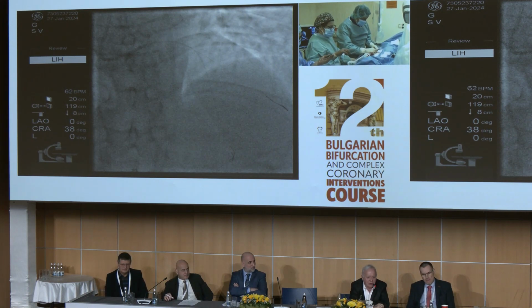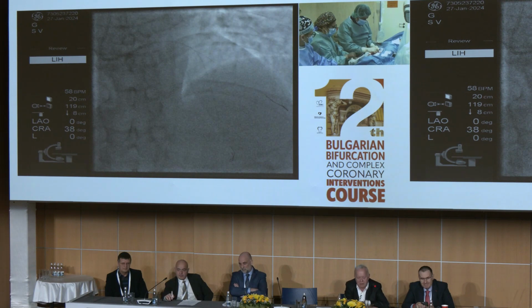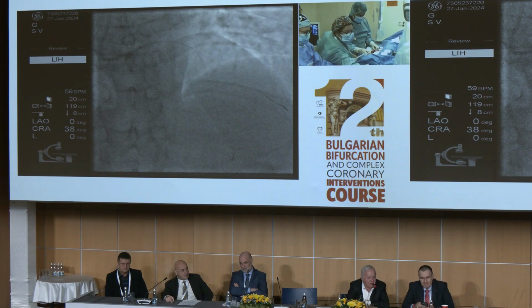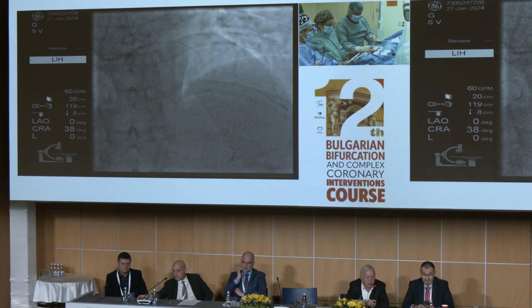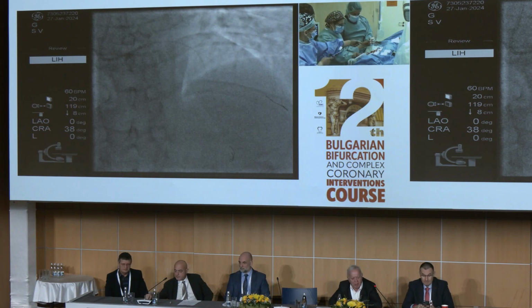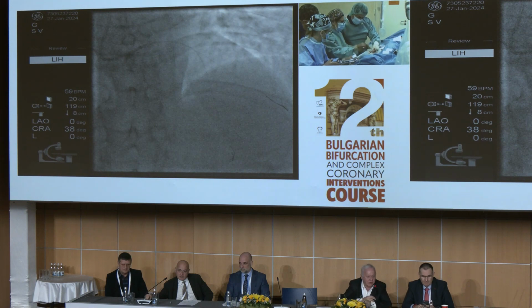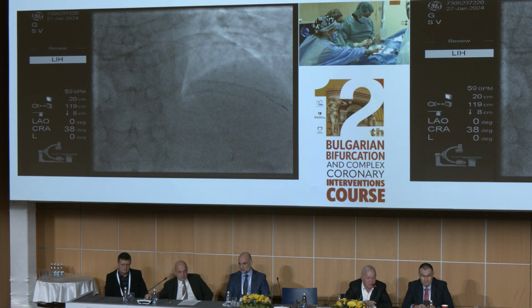3.0. Can you look at the reference, the nomogram, to see at which pressure you reach 3.2? It's on the box normally. For 3.2, it's 13 atmospheres. So we have to give 12 or 14. Yeah, give 13.